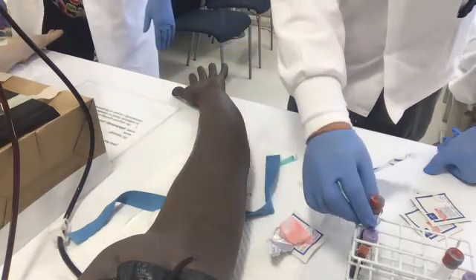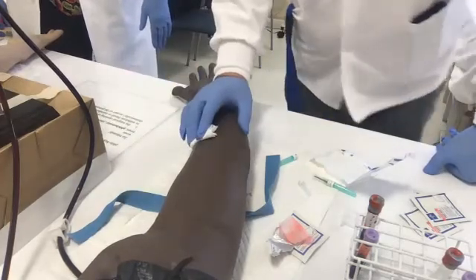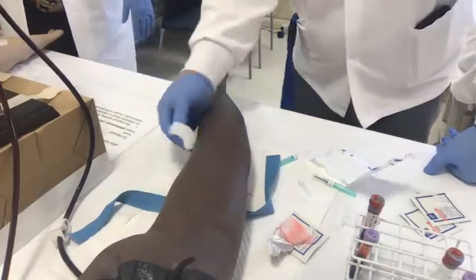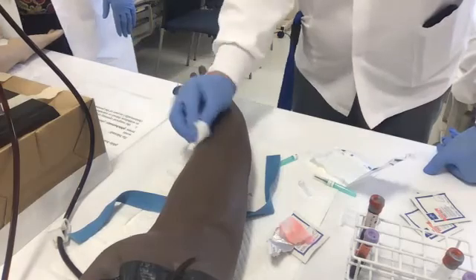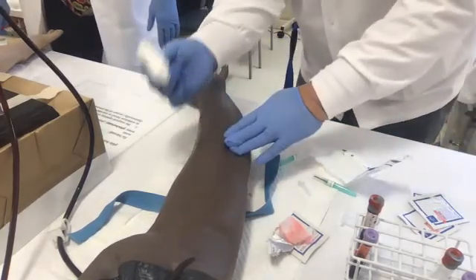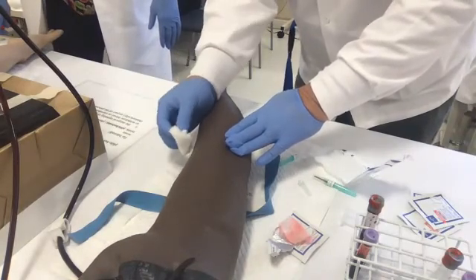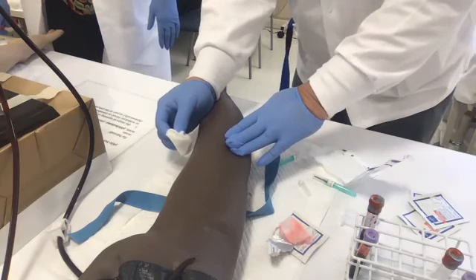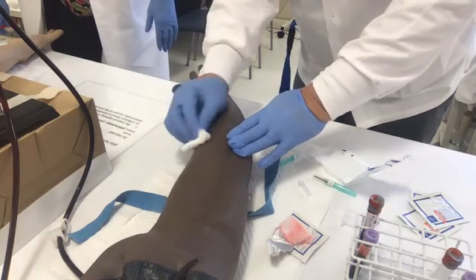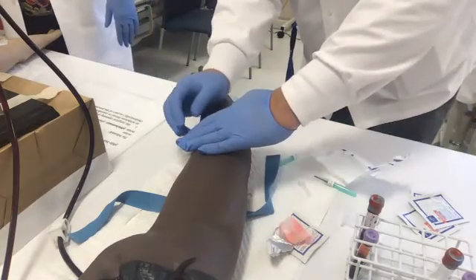And so when it's done, you have the gauze here. Hold for 1 minute and then check, right? Is he still bleeding? Now, if he's still bleeding, I have to get another gauze, and I do not remove this initial one, because if you remove the initial one, it removes the platelet plug, and then my patient's going to start from 0 and bleed again. So even though this is soaked, get another one on top of here.